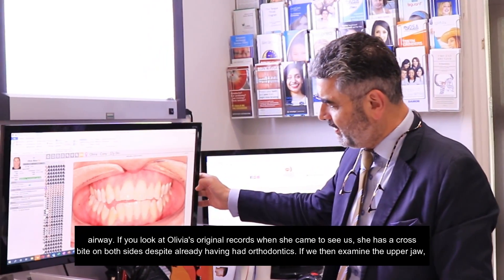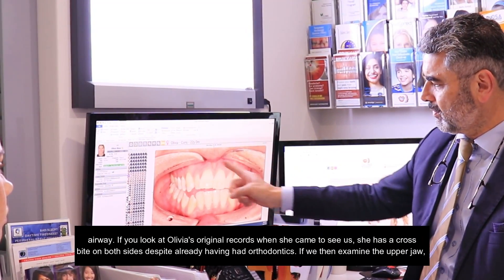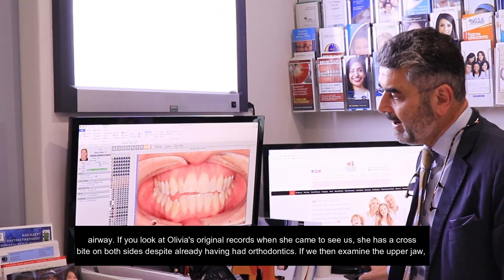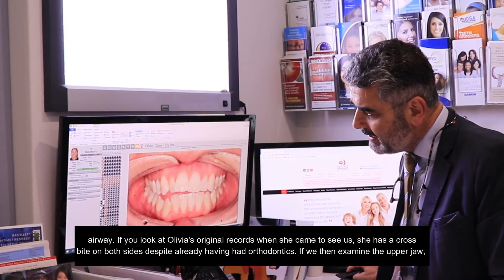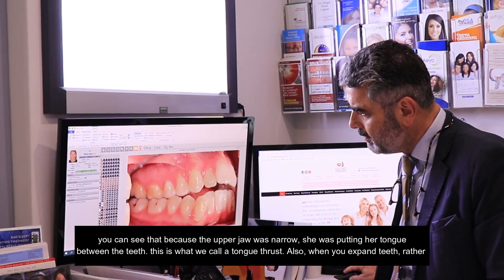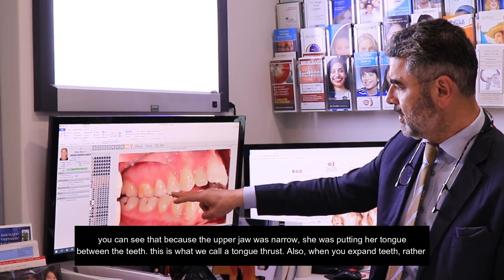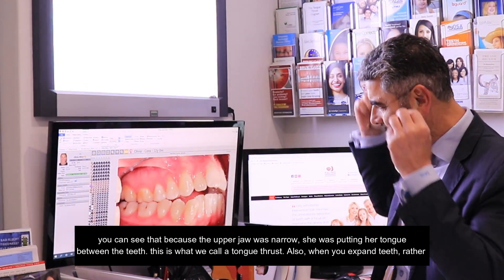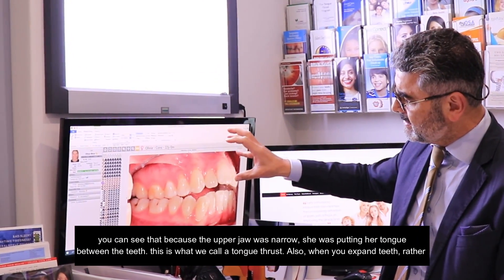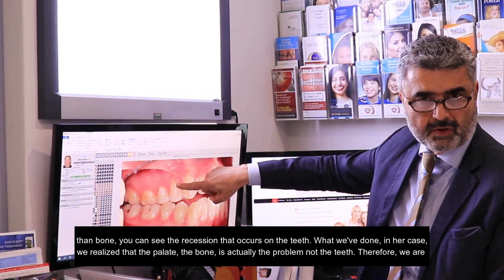If you look at Olivia's original records when she came to see us, she has a crossbite on both sides, besides already having had orthodontics. If we then examine the upper jaw, you can see that because the upper jaw is narrow, she is putting her tongue between the teeth — this is what we call a tongue thrust. Also, when you expand teeth rather than bone, you can see the recession that occurs on the teeth.